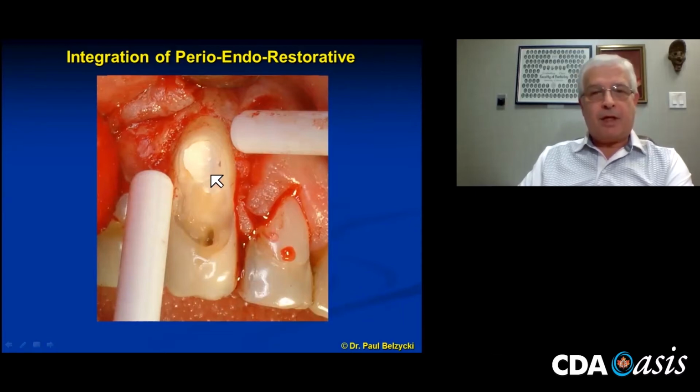So at this point, it looks as if I have some good surface area for a soft tissue attachment. I'll just take that away. You need about 1.5 millimeters to 2 millimeters. And I thought that looks reasonable. I've tried to highlight it there.